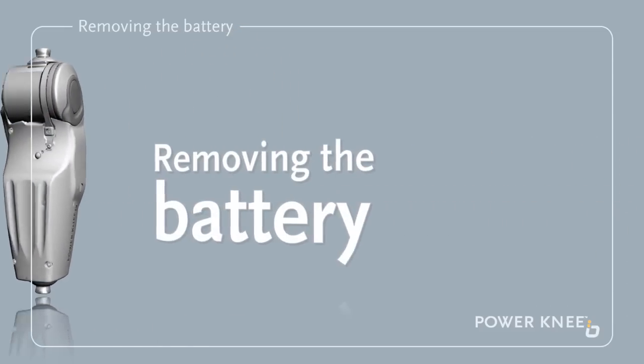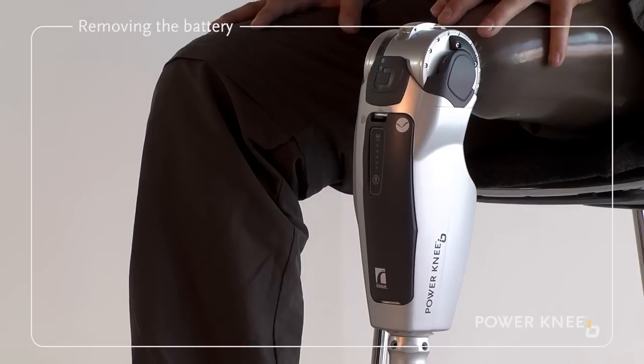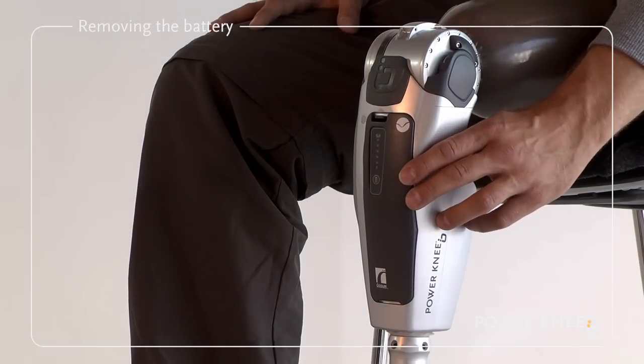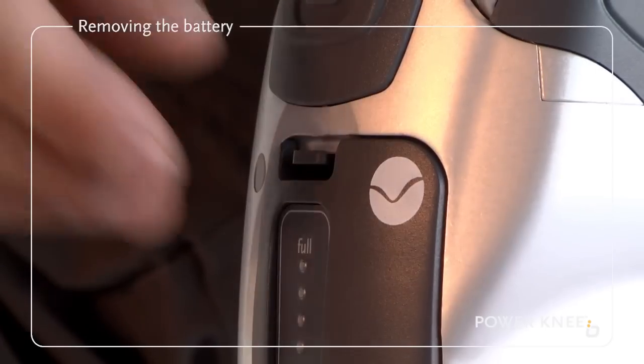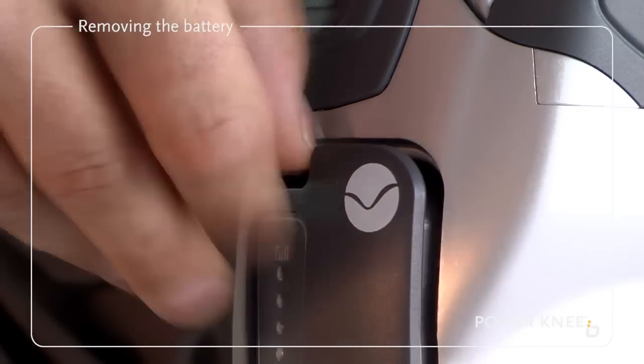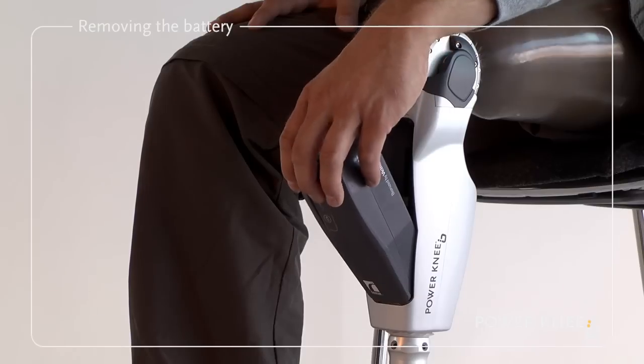Removing the battery. First, make sure the Power Knee is turned off. Push down the lock tab as shown, then release the battery in the direction of the arrow.